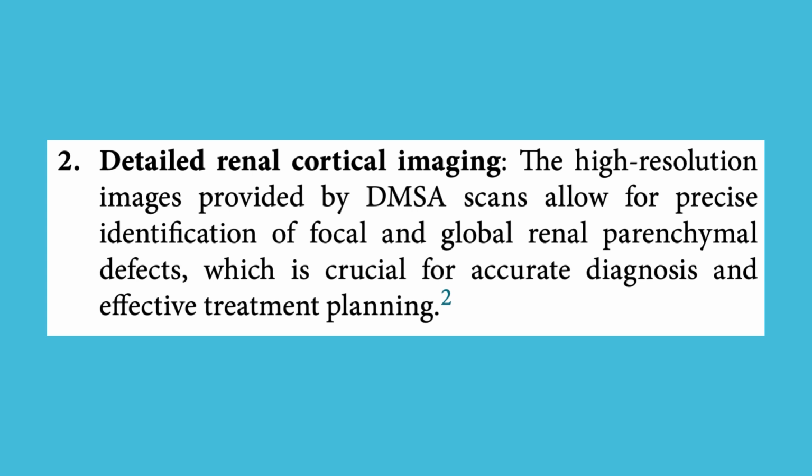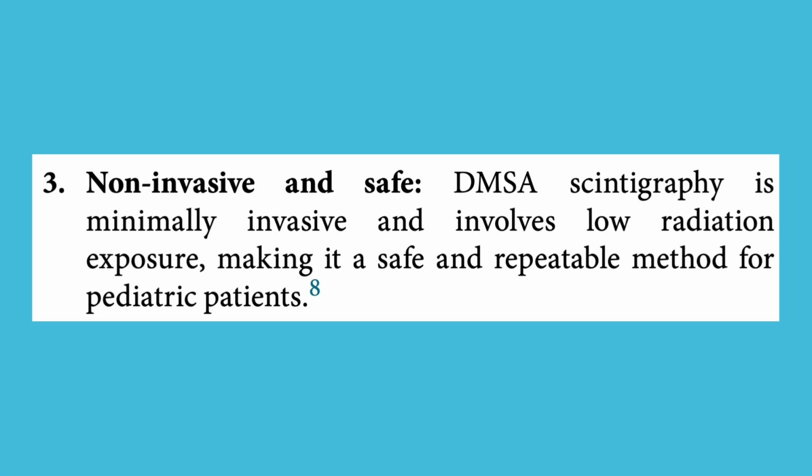2. Detailed renal cortical imaging. The high-resolution images provided by DMSA scans allow for precise identification of focal and global renal parenchymal defects, which is crucial for accurate diagnosis and effective treatment planning. 3. Non-invasive and safe.